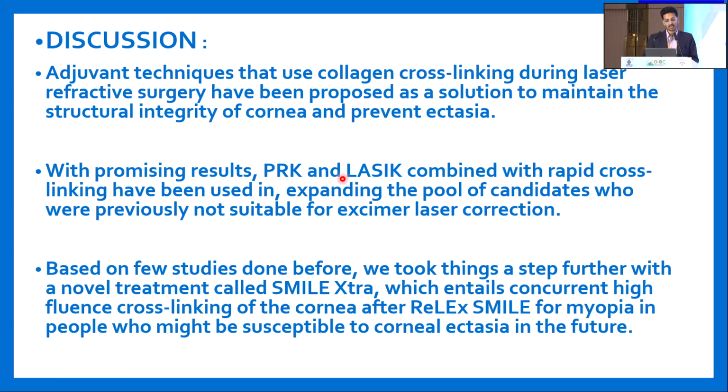Coming to the discussion part, adjuvant techniques that use collagen cross-linking during laser refractive surgery have been proposed as a solution to maintain the structural integrity of the cornea. With promising results, PRK and LASIK combined with rapid cross-linking have been used to expand the pool of candidates, which can be operated for SMILE as well. Based on the few studies done before, we took a step further and did it for SMILE Extra.